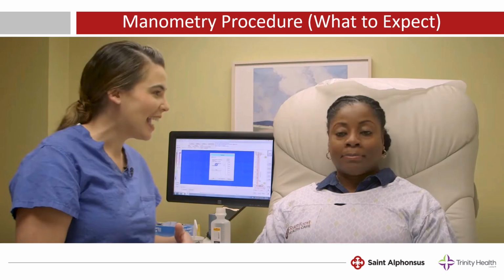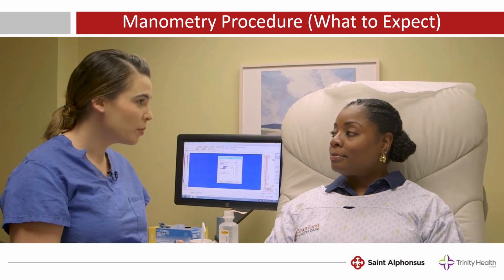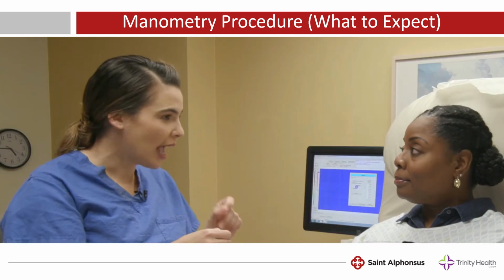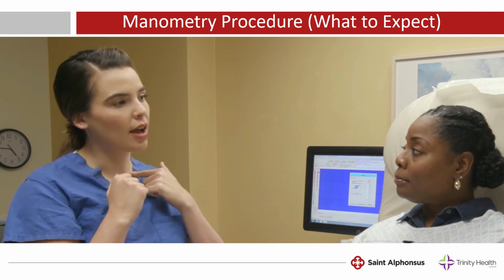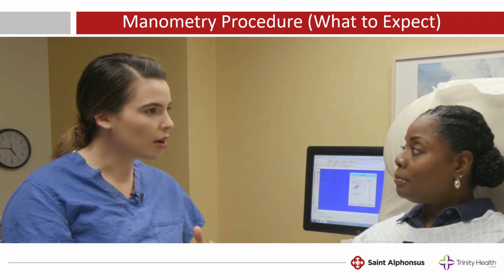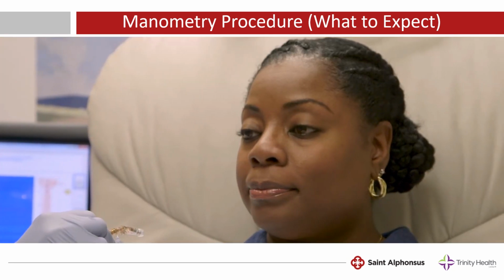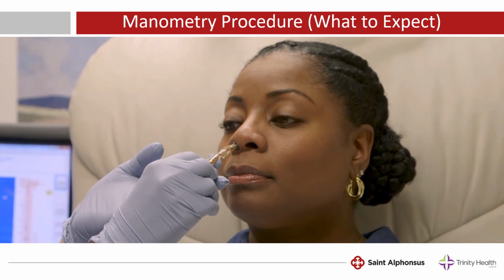This video is a good demonstration of how a manometry procedure is performed. It will help you understand what to expect on the day of your procedure. We are going to be doing an esophageal manometry procedure. It is a small flexible catheter, goes down one of the nostrils, down your swallowing tube, your esophagus, and sits right about the tip-top part of your stomach. It shouldn't be painful, but might be a little uncomfortable. During the procedure, you might have some gagging, some discomfort in your throat, and possibly watery eyes.